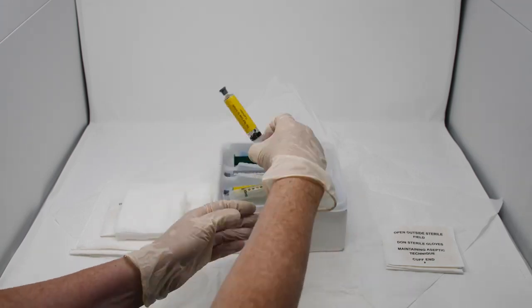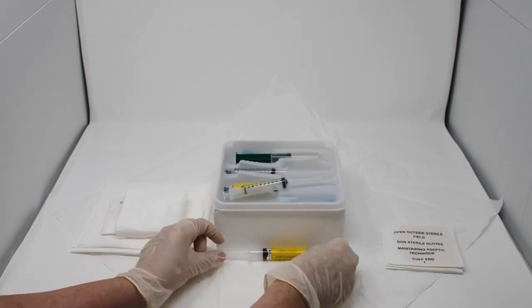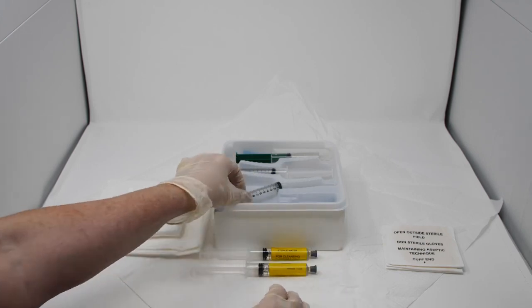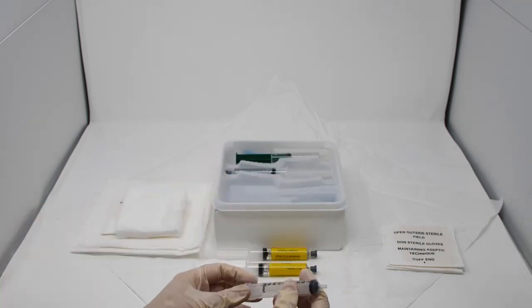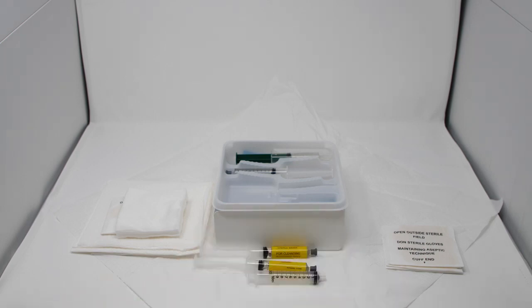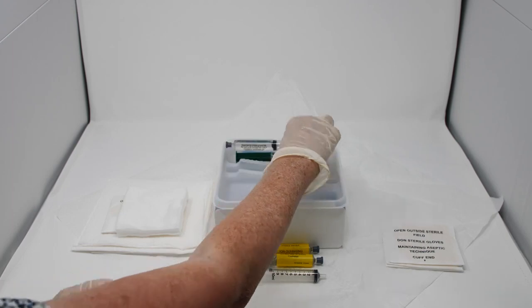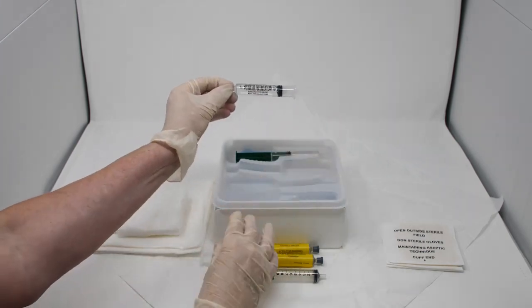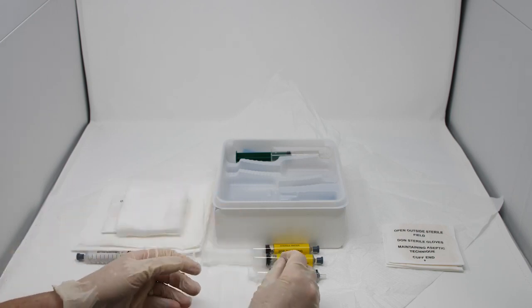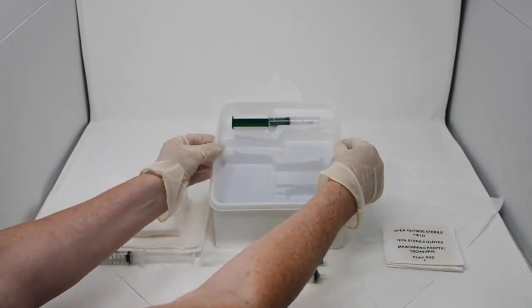Two syringes with sterile water for cleaning are easily identified by the yellow labels. One empty syringe can be used if the patient has a catheter that needs removing, or it can be used to take a clean, sterile sample of urine through the sample port. The fourth syringe contains 10ml of sterile water to inflate the catheter balloon. The tray can be used when empty for the sterile water when cleaning.